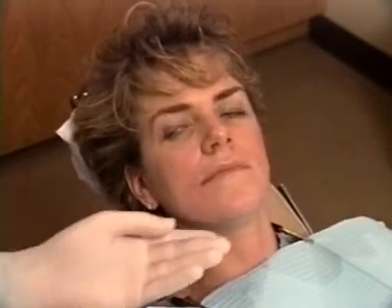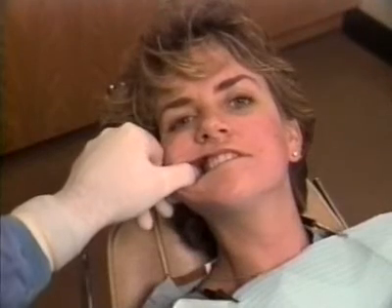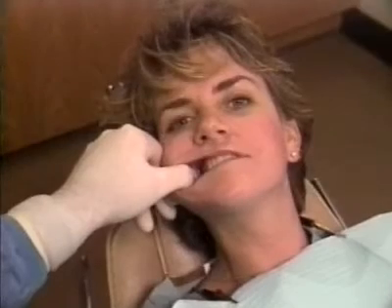With the patient's head adjusted to facilitate visualization of the retromolar region, the cheek is retracted with the thumb to expose the insertion point midway between the ramus and the maxilla at the height of the mucogingival junction of the maxillary molars.